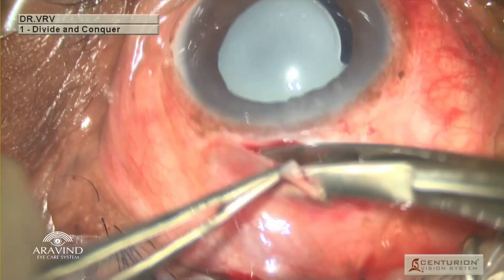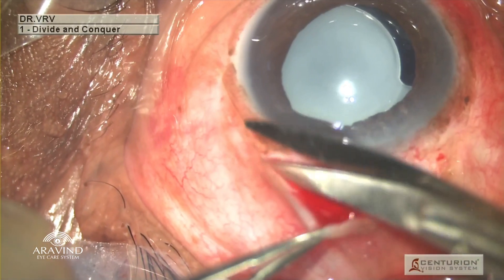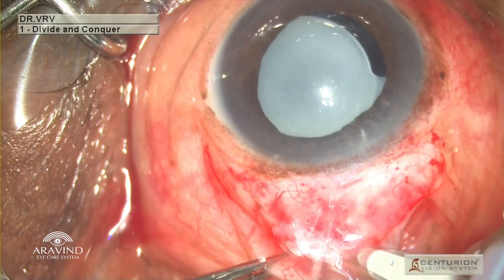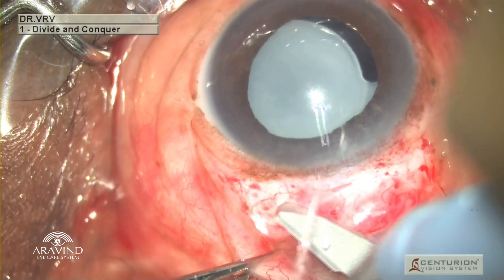As the conjunctiva was fibrosed and dense at the limbus, peritomy was planned a little bit posteriorly so as to avoid conjunctival tear. Peritomy is then performed carefully. I prefer to avoid scleral cauterization in such cases, as the conjunctiva and the underlying sclera are already fibrosed because of the previous surgery.